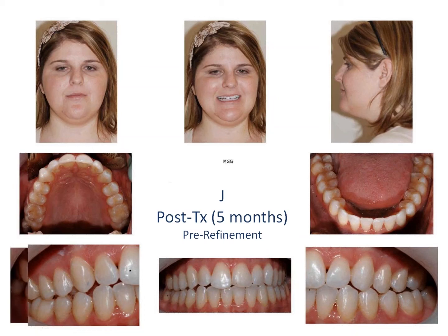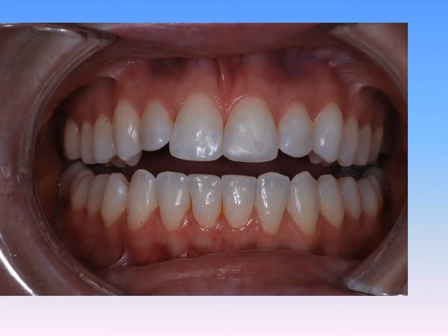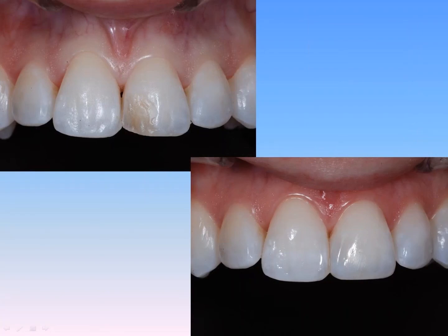So we went ahead and straightened her out, got her bite straightened after refinement, and then we went ahead and replaced the old composite up front there, which was darkened, and took it off and placed a nice composite on. You can see there's a little bit of a proportion issue, but that would take a little bit of a gingivectomy to help get, and she was happy with the way it turned out.